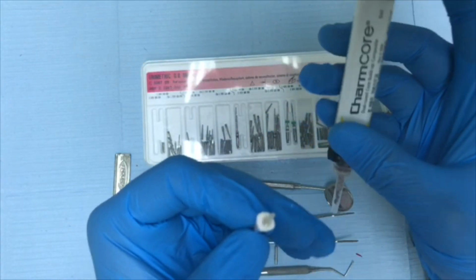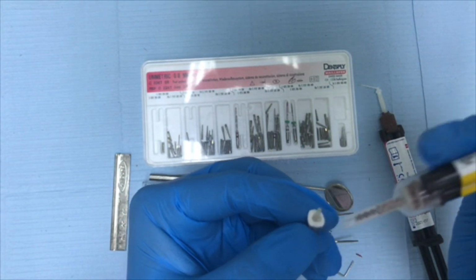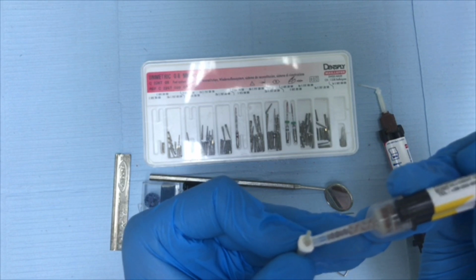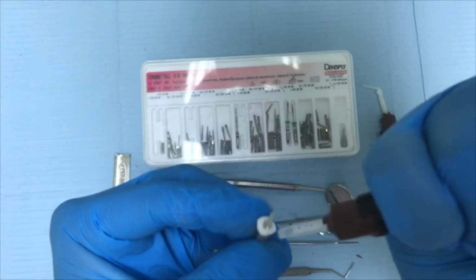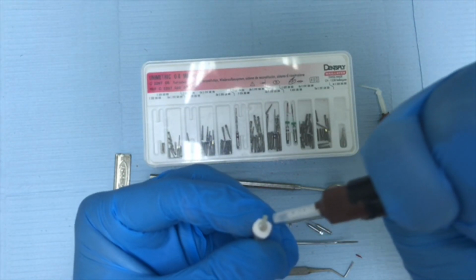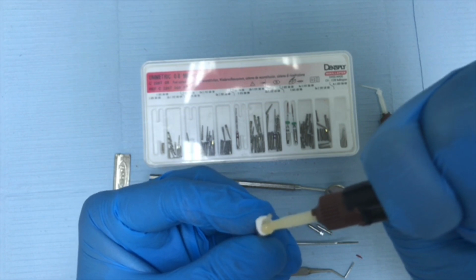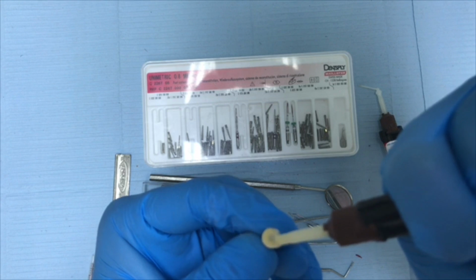Start off by placing your dual-cured core build-up composite material in order to restore the original shape of the tooth. Inject the core build-up material in this area around the post.